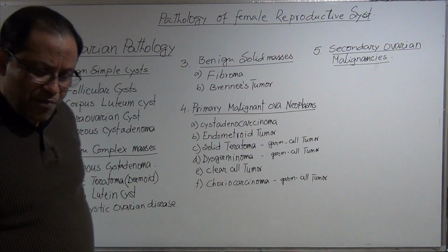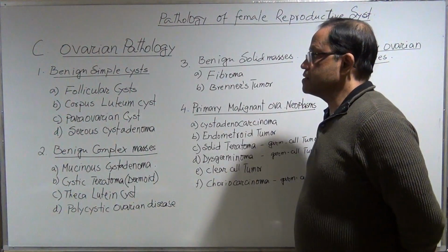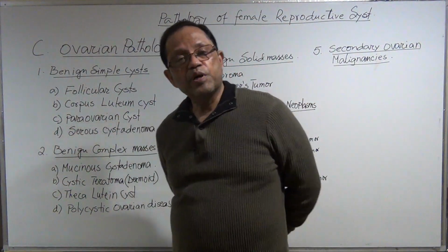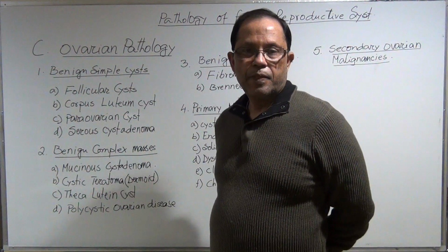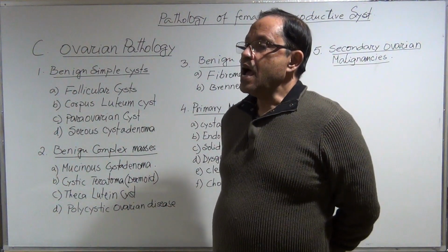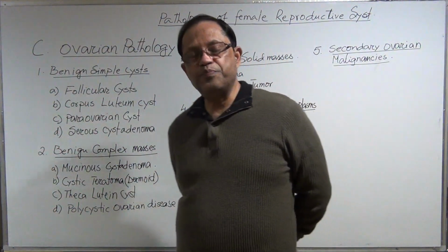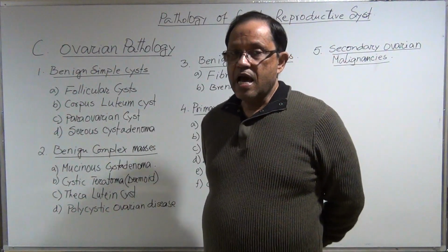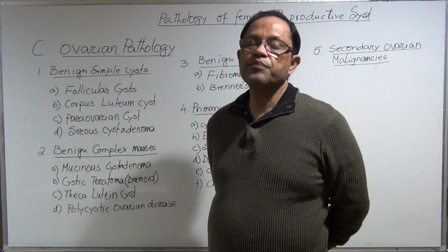Benign means not malignant, not harmful, and the cysts are simple in nature. Why do we call it simple? Because it maintains the 4 criteria. Those 4 criteria are: the wall should be thin, smooth and regular, and there will be anechoic or sonolucency in the center.